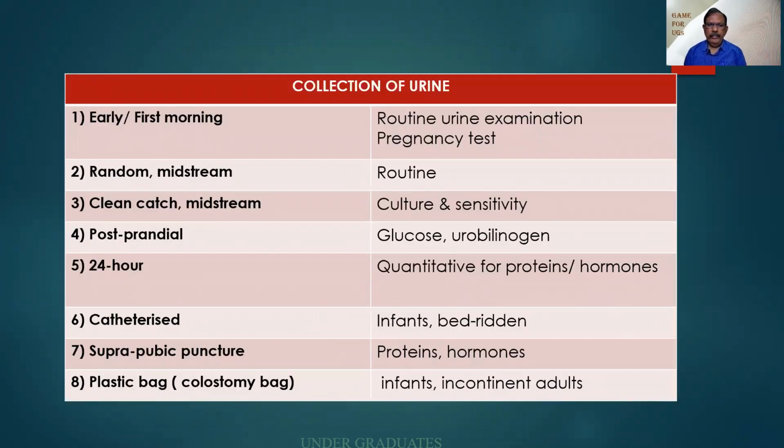Collection of urine. Students directly have a tendency to go to the Benedict solution or for the protein test. But they should realize that marks are being allotted for the physical examination, coming to a diagnosis, performing the clinical experiment, as well as answering the questions the examiner asks.